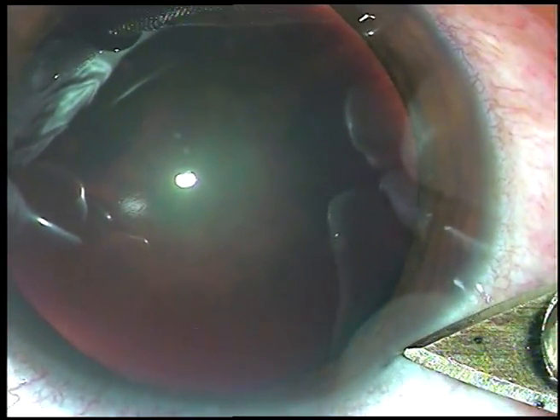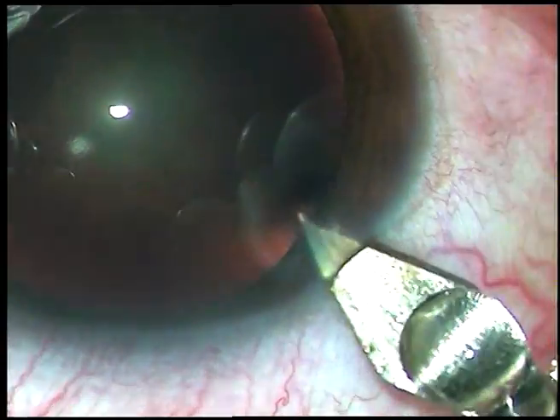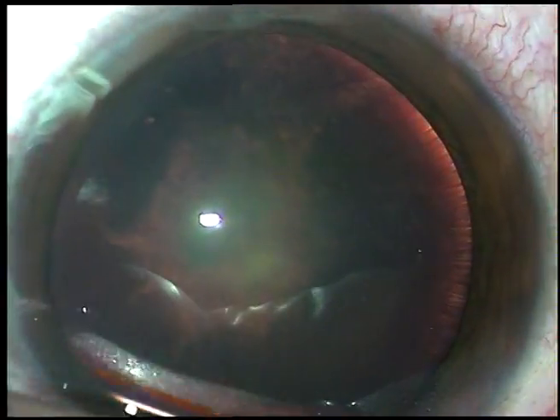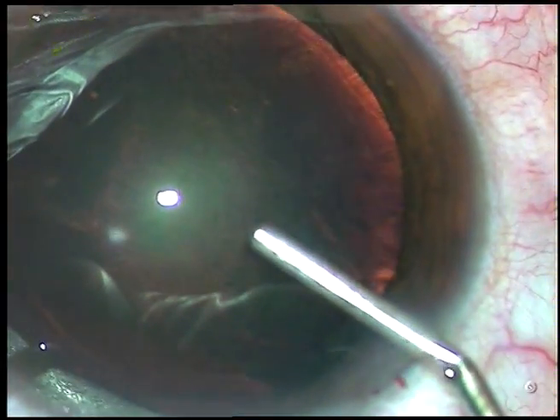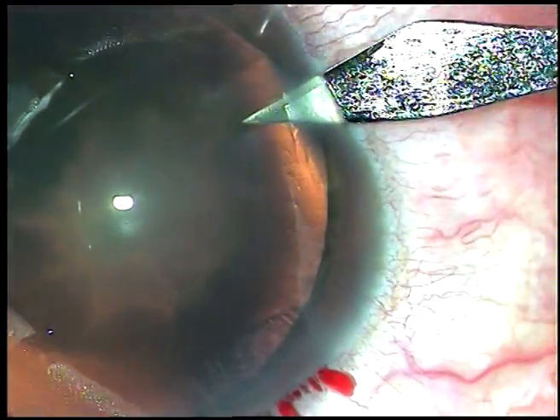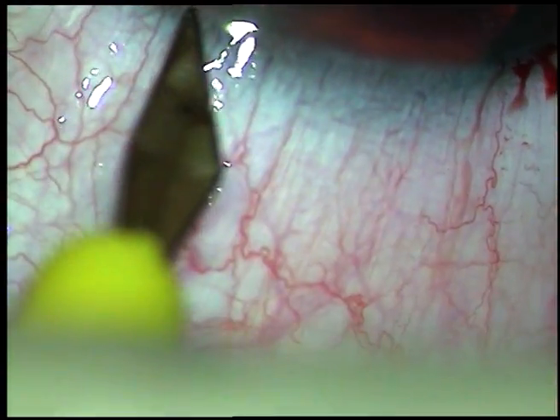Friends, this is a posterior subcapsular cataract. The patient is a 40-year-old young lady and there is no cataract in the nucleus. The nucleus is clear. This is soft lens matter and I have planned to do phacoaspiration in this case.